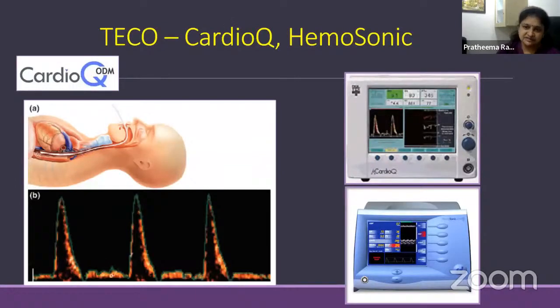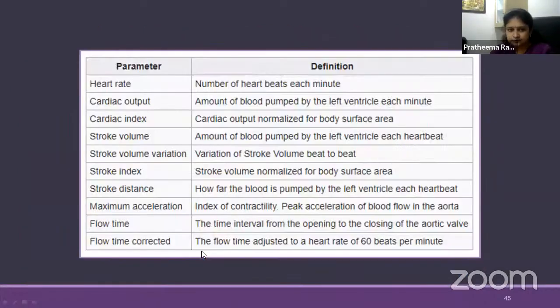So this is how it is seen. The probe is placed in the patient's esophagus, looking at the heart. We are not going to get any images, only Doppler graphs. And we can see that again the cardiac output is monitored, and how the changes reflect on the blood flow. Every time blood crosses the root of the aortic valve, it is seen like this. A lot of variations and parameters are seen.